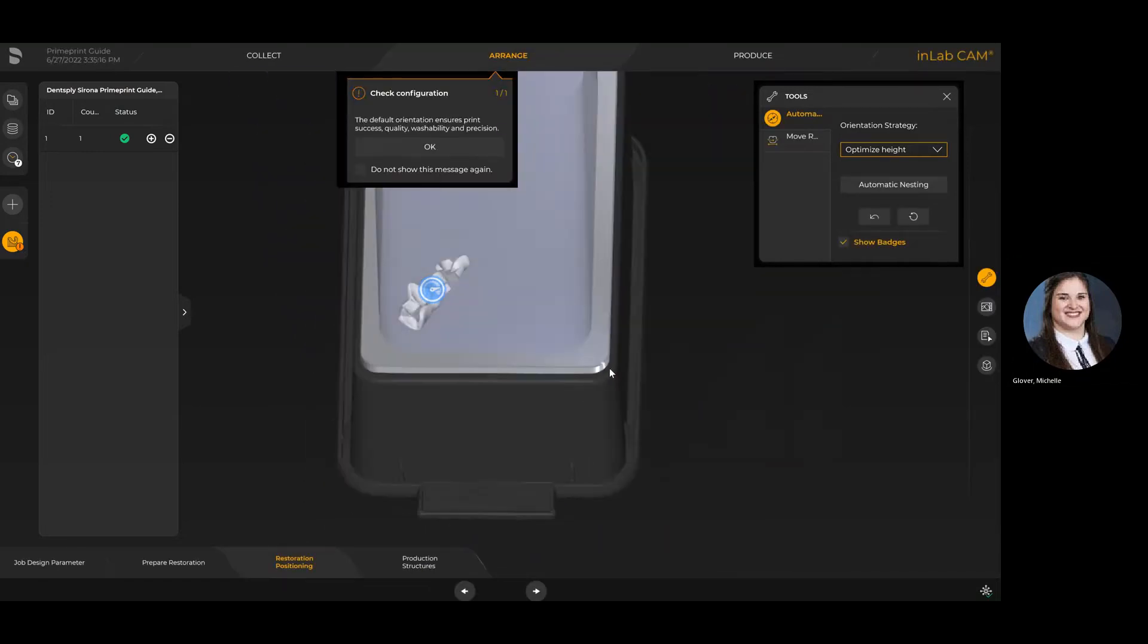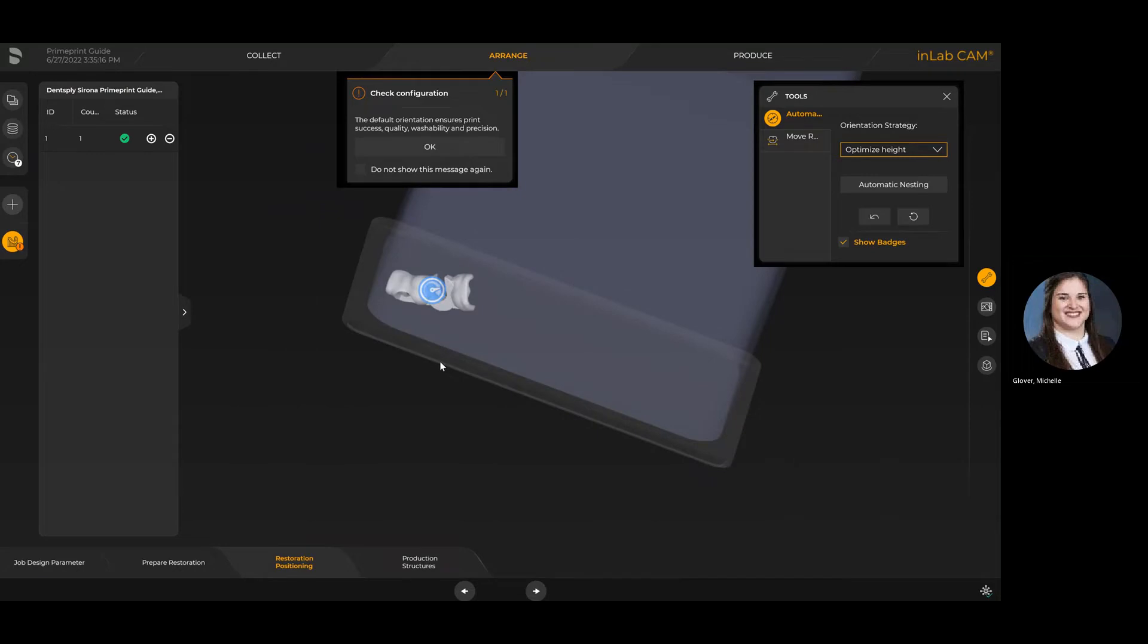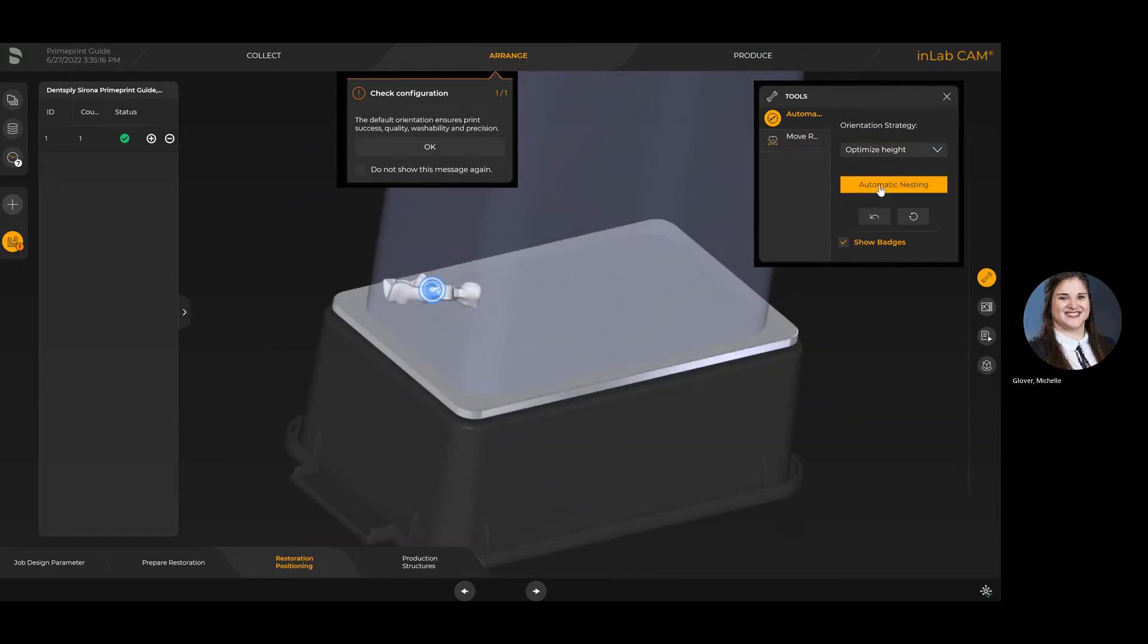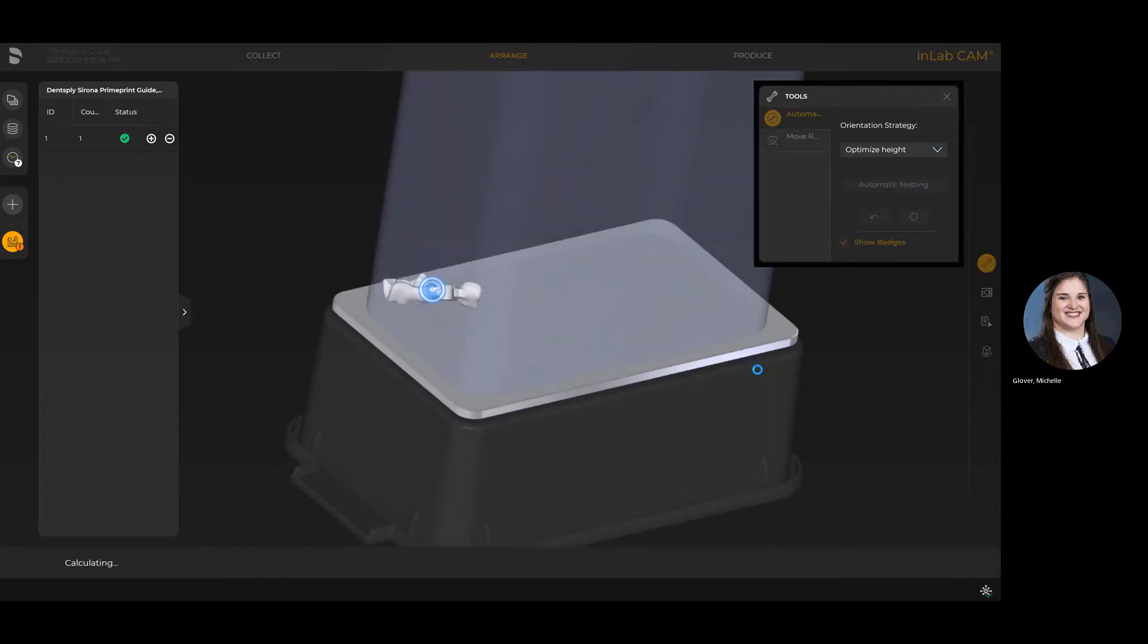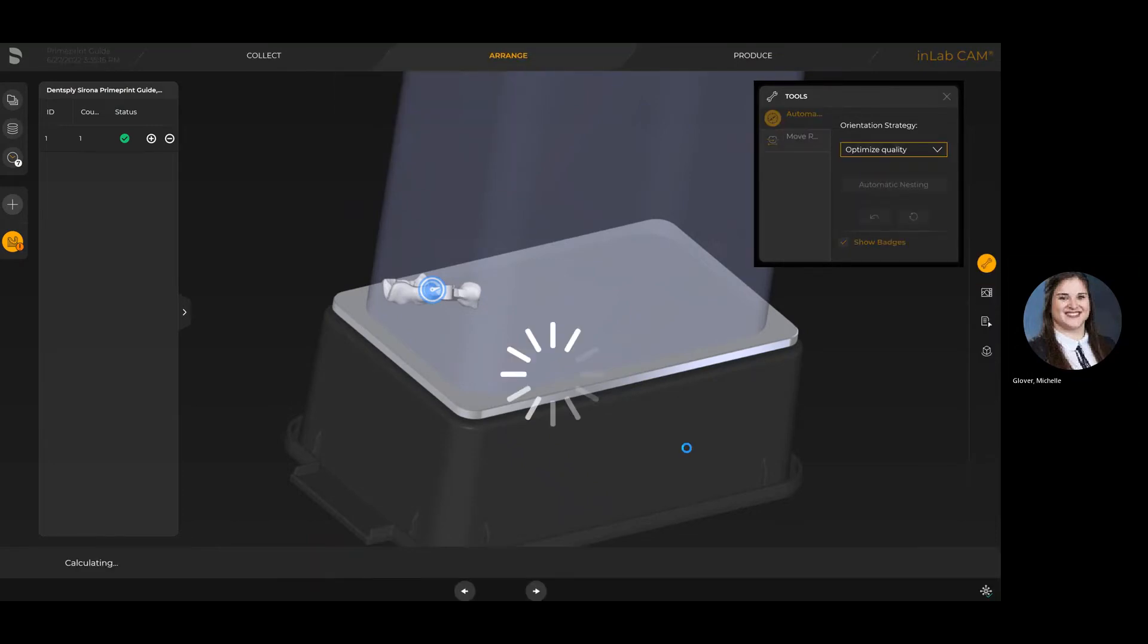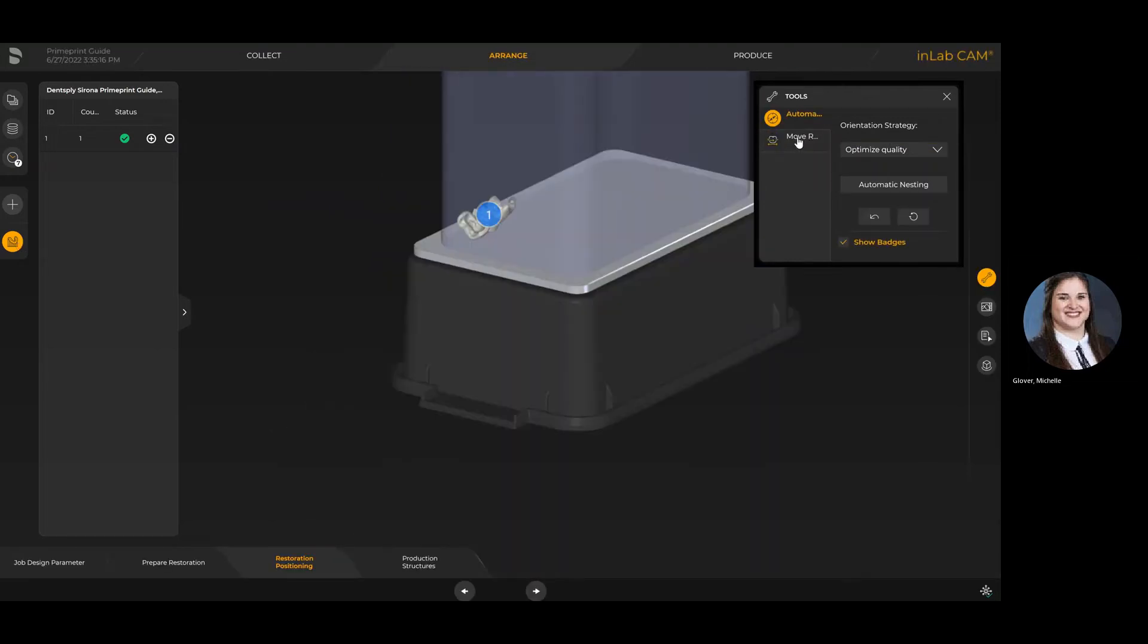The last option is optimizing the height, which would be more if you're looking for speed. When we look at optimizing speed, it will unfortunately mean that we lose a little bit of accuracy, so you do lose some microns there. I'm going to put it to optimize quality, which is what it defaults to.